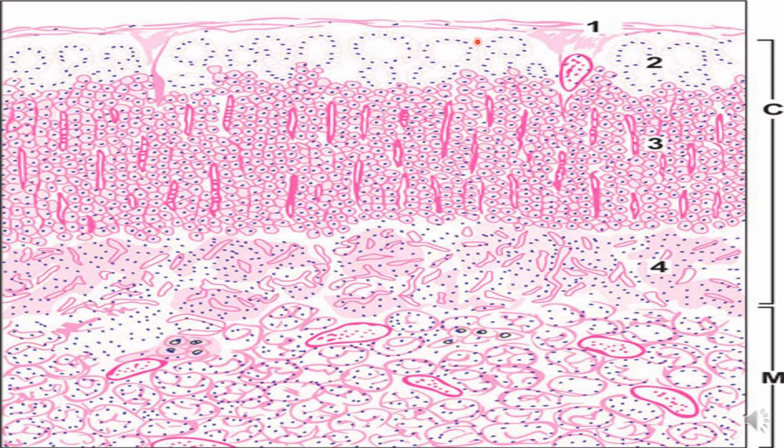So in this figure, this is the zona glomerulosa. The outermost layer comprises 1/5 of the thickness. Okay, and you can see the cells are arranged in an inverted U-shaped manner, similar to that of an acinus, right? So this is the zona glomerulosa.